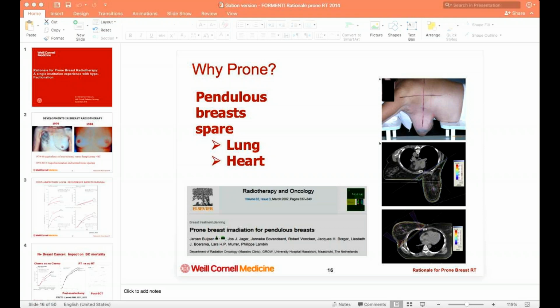I hope that's sufficient. Dr. Ella Nwachukwu asked, how often do you do portal imaging throughout the treatment? And what do you do when you have scars extending to the posterior axilla? Great question. So I do portal imaging at the first treatment and then once every 5 treatments.